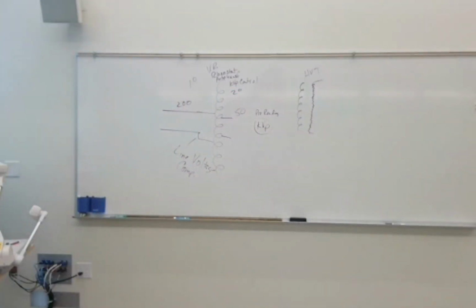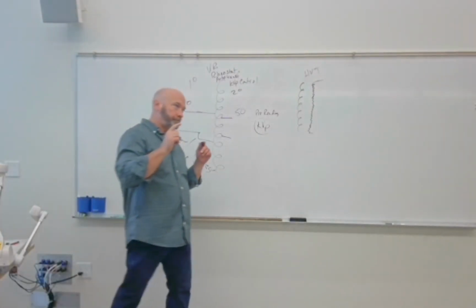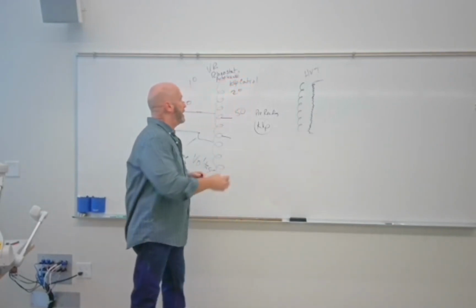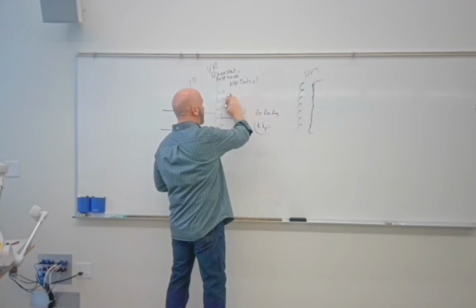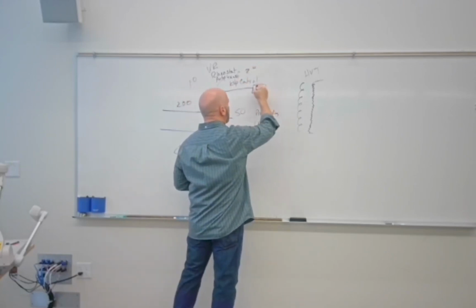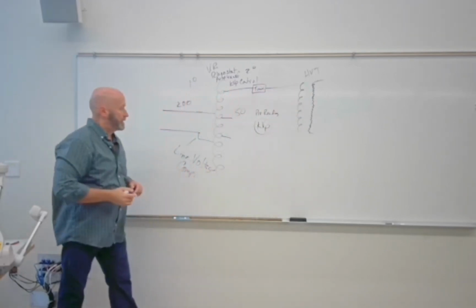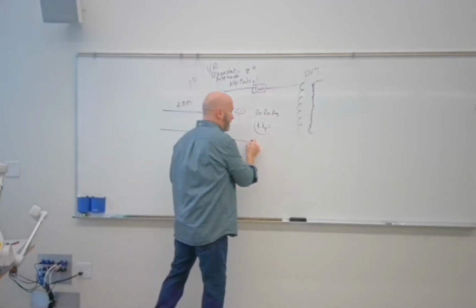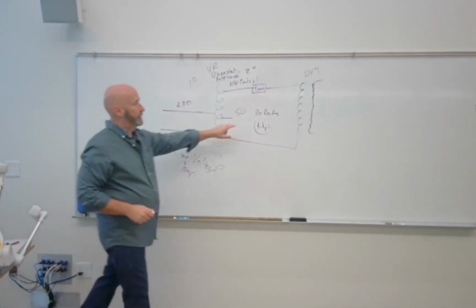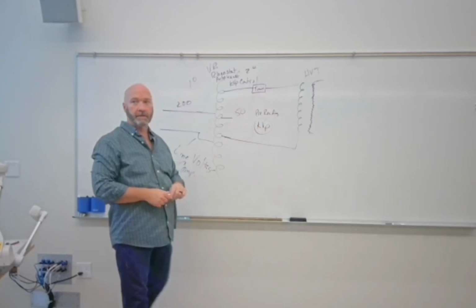Also, though, what we're going to have over here is, remembering that we've got kVp and mAs has two components, that's mA and time. We have to have a timer circuit as well. All right, so a timer circuit is over here as well. Our voltage comes out of the autotransformer and it goes into the step-up transformer. We have a kVp meter over here on the low voltage side. We have a timer over here on the low voltage side as well.